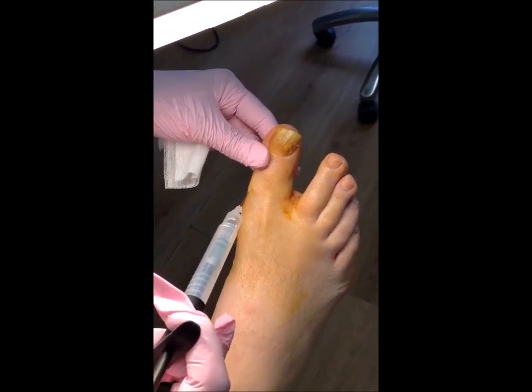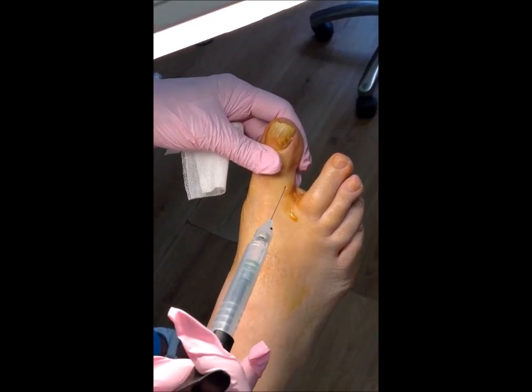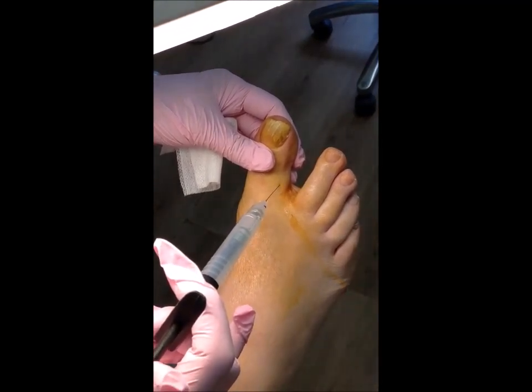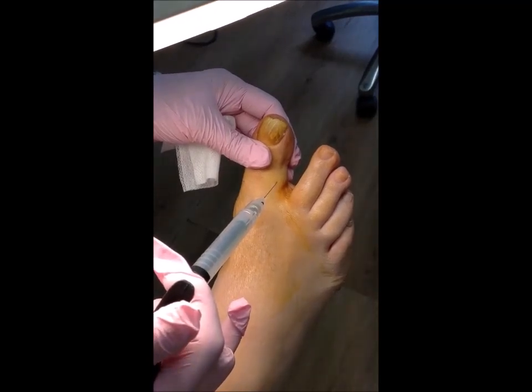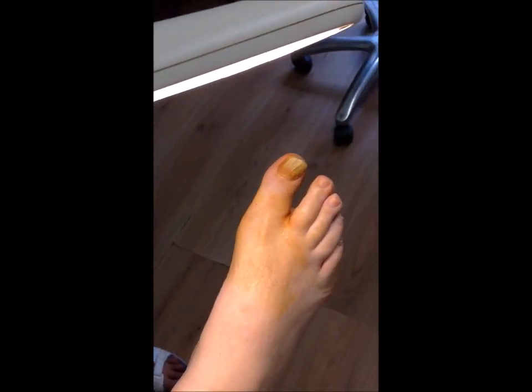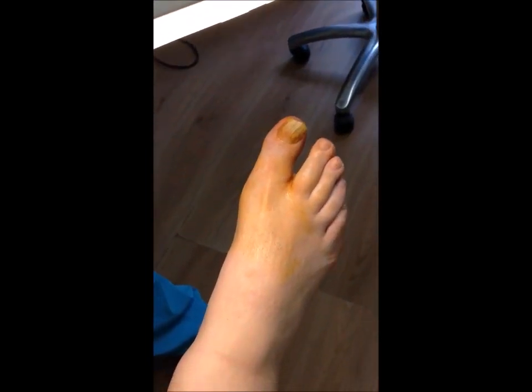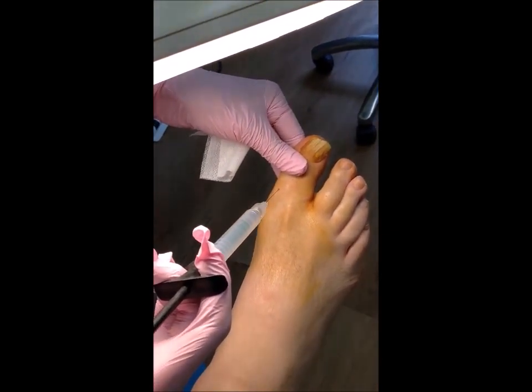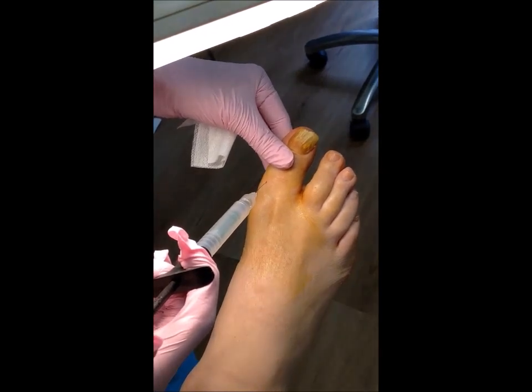I'm getting the top and going back over to the other side, going further down to reach the plantar innervating nerves. So just gently getting that in — that's one in, and I'm just going to put another cartridge in because one won't do it. I want to ensure that this is a totally painless procedure, so I'm now going to go back in to where I started, just going deeper down this time to get a bit more in there.